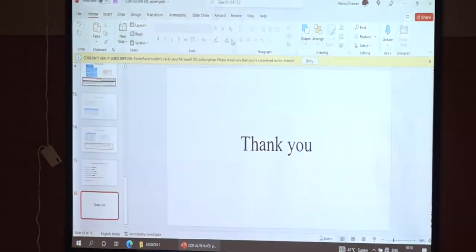Thank you, Dr. Kesha, for axial length. So the IOL Master 700, which has the Barrett suite, has the Barrett's Universal 2, Barrett's Toric, and the Barrett's True-K. Toric is for the toric IOL calculation, and True-K is for the post keratorefractive surgery patients, post RK patients, post LASIK patients. So Barrett's Universal 2 is applicable for all axial lengths.